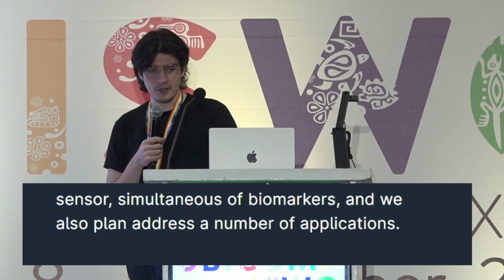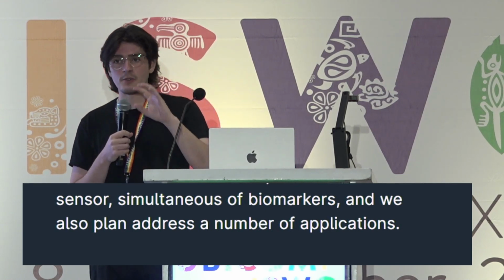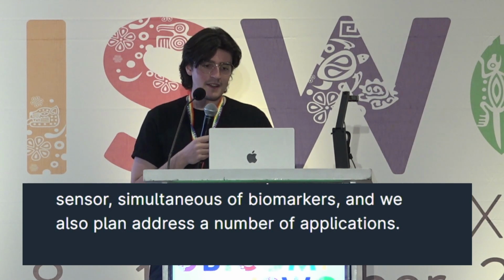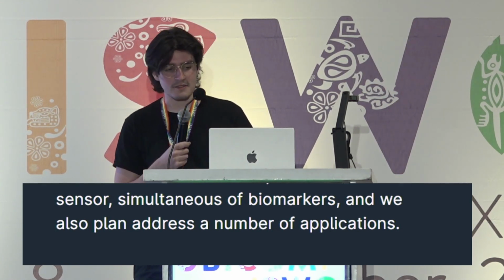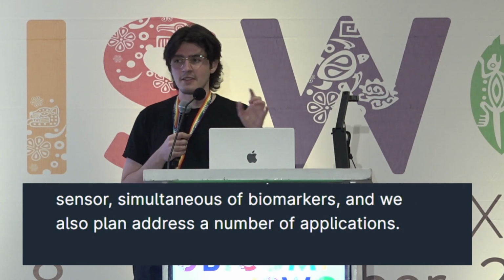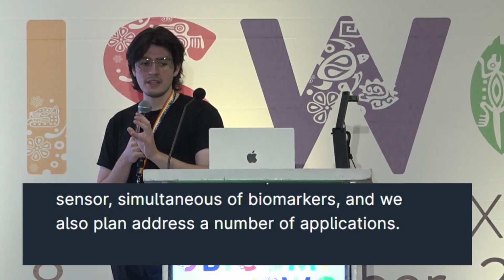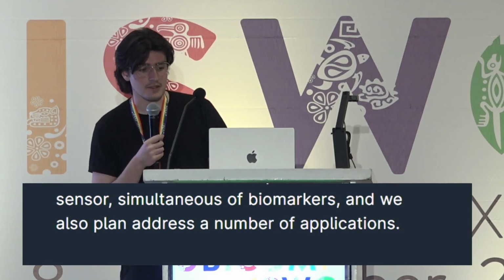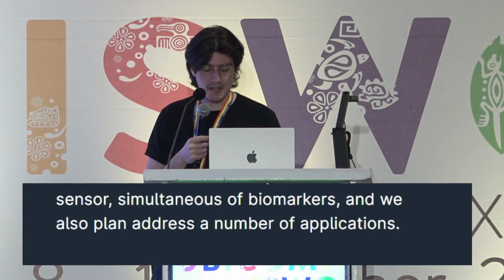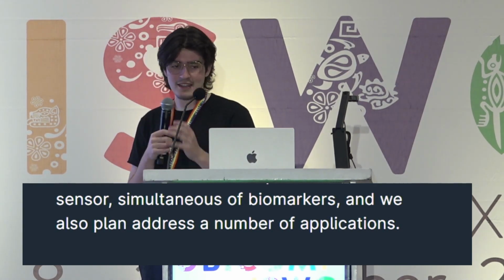And so, once we have this representation of Newton's law of cooling, which is summarized in a briefer duration of time using this linear line of best fit, we can still learn that transfer function empirically, mapping that summarization of Newton's law of cooling to the actual core body temperature of the users measured by a state-of-the-art oral thermometer. But what if people have different sized foreheads? So we thought of that.